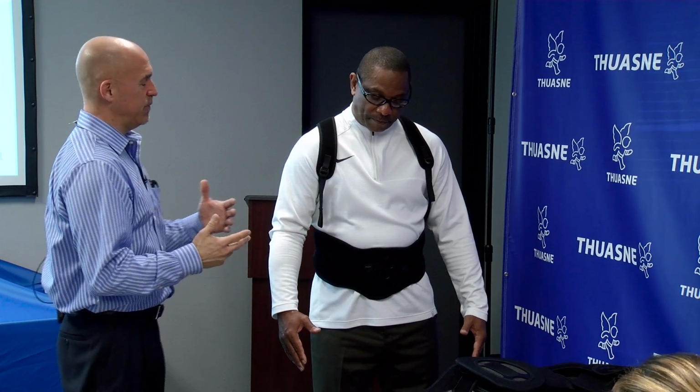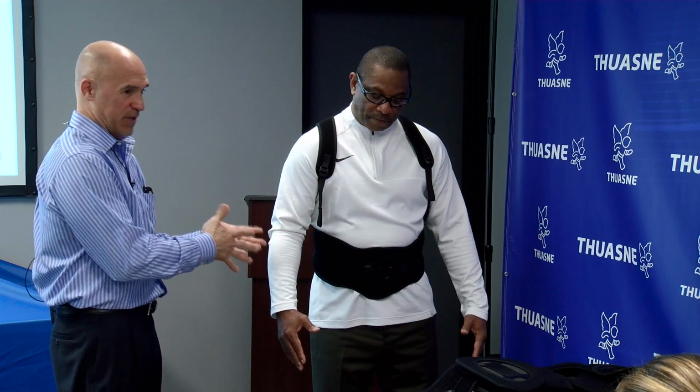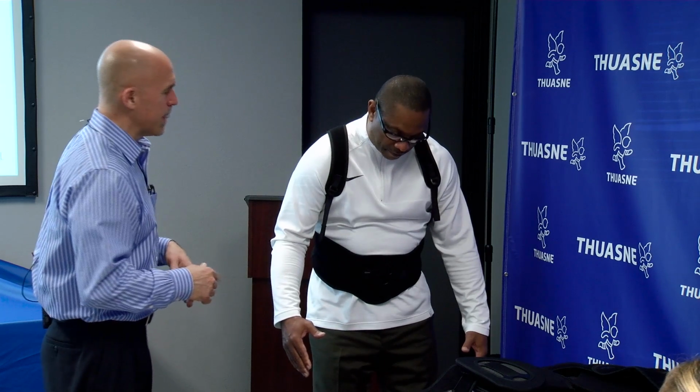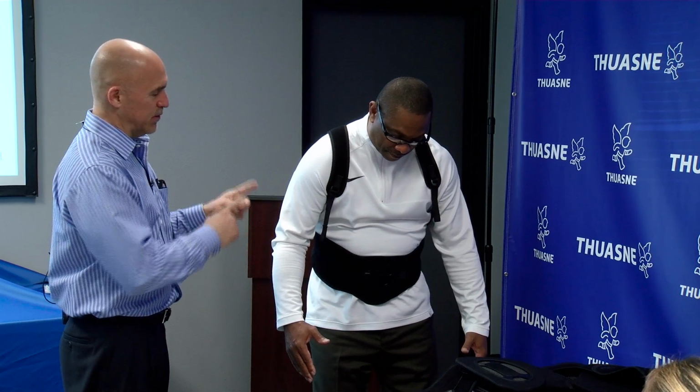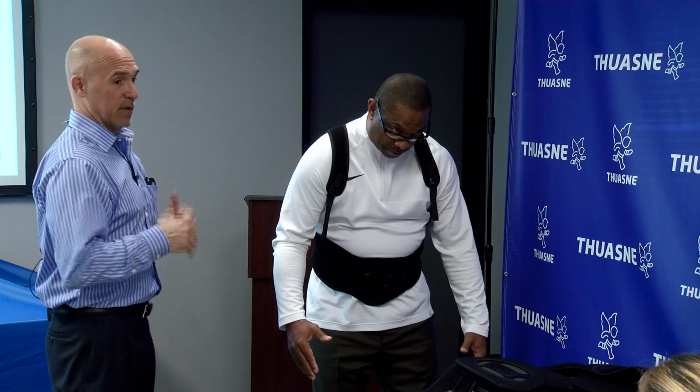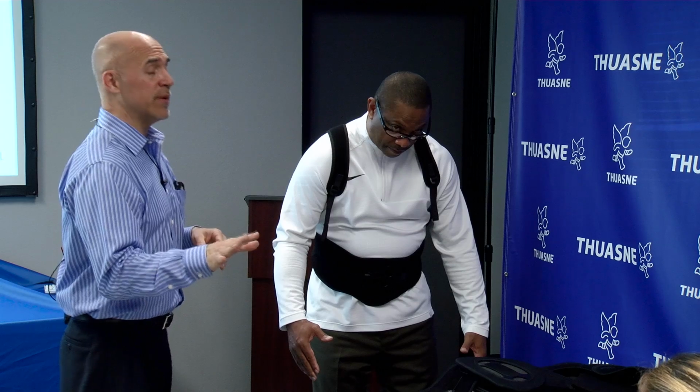All right. So now, critical component here. If you envision the little old lady that this brace is for, the kyphotic issue, maybe lean forward like that. Now if the little old lady were to tighten these straps, where are they going to get pressure? Right on their traps, on the top. And what are we trying to do? We're trying to get them to stand up straight. But if you push them too hard, they're not going to like it. Right. Well, we're not going to push them.